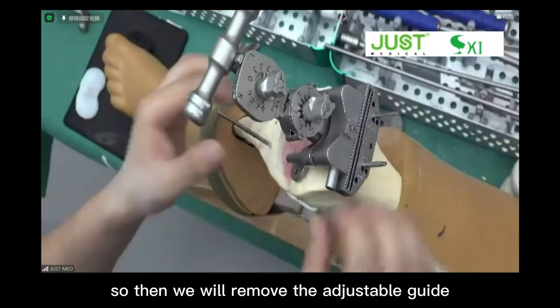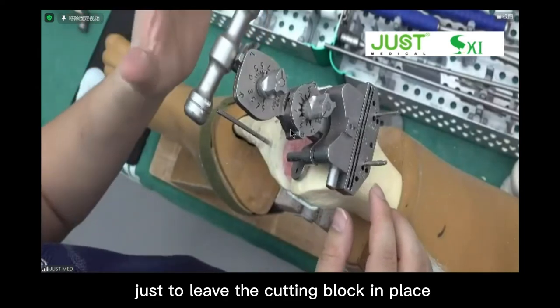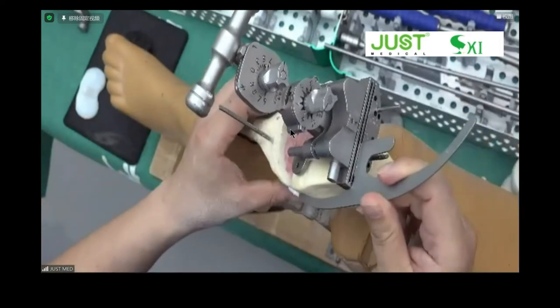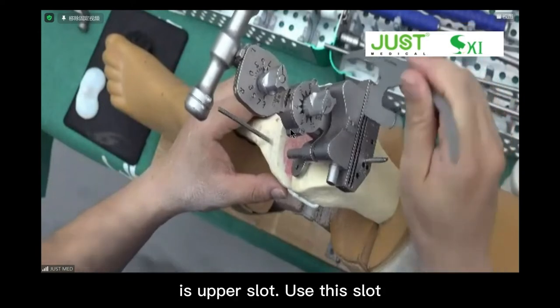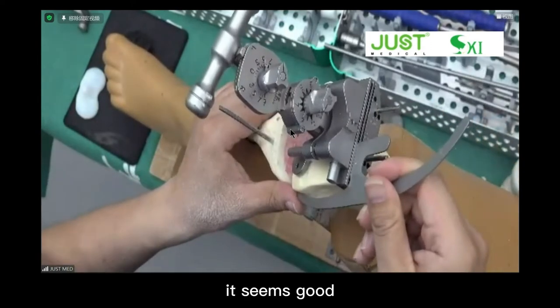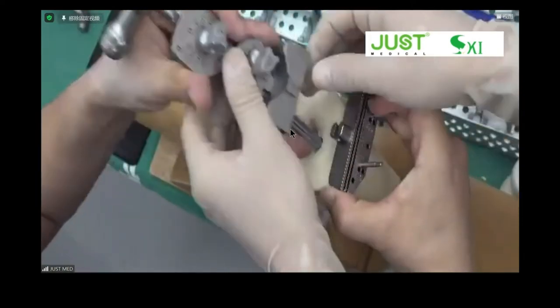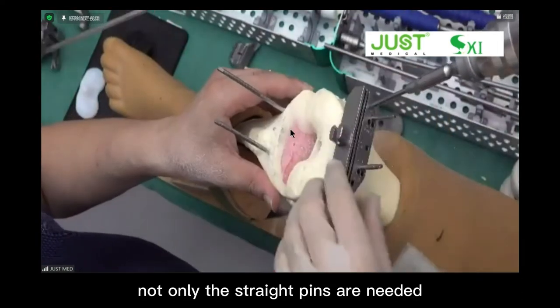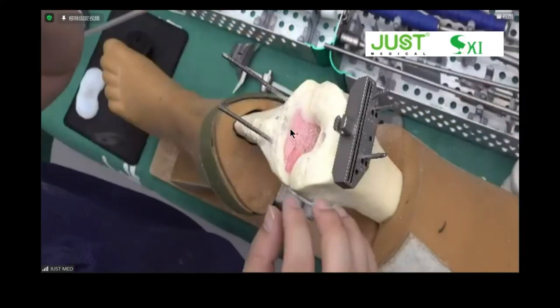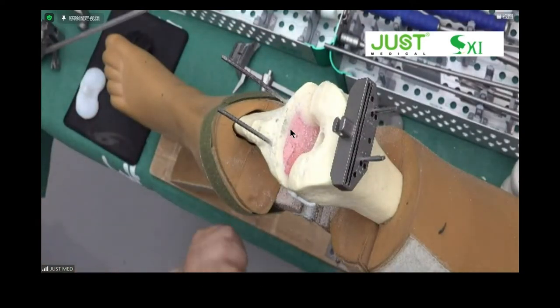Okay, so then we remove the adjustable guide, iron rod, and so on, just to leave the cutting block in place. Before that, we would like to see with our eyes if the resection is good. The standard cutting is the upper slot, use this slot. It seems good, so we just remove other parts and only leave the cutting block. Not only the straight pins are needed, we need an oblique pin to make sure it doesn't move. The three pins are enough. Now we can do our first cut for the femur, a flat cut.